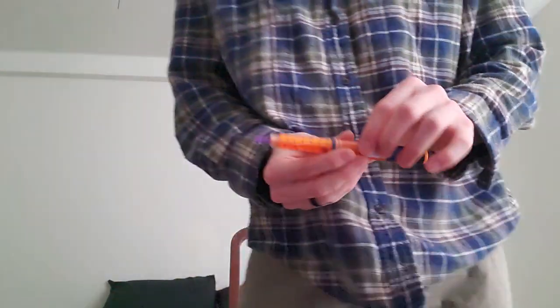Okay, that's done. I'll put that to the side. Again, you should already have your set dosage from your doctor. They should tell you how much you need to use, what kind of insulin. So make sure that you're following that plan that they give you. You don't want to do too little insulin or too much. You want to make sure it's the right amount.